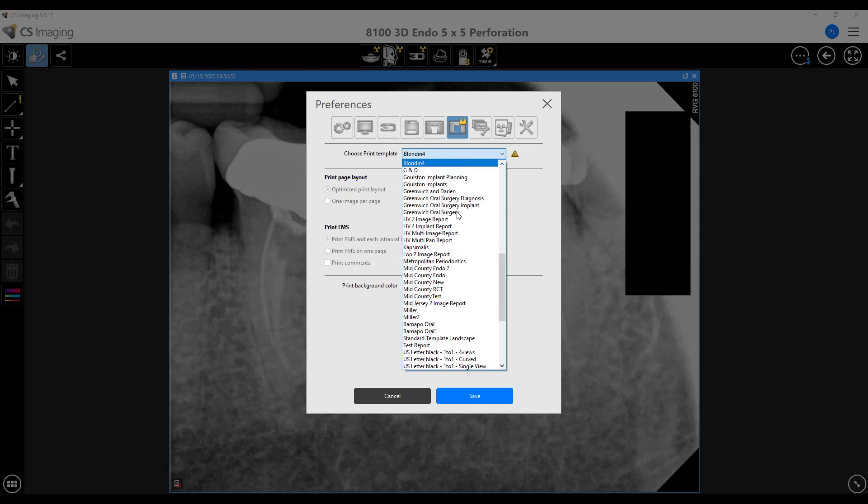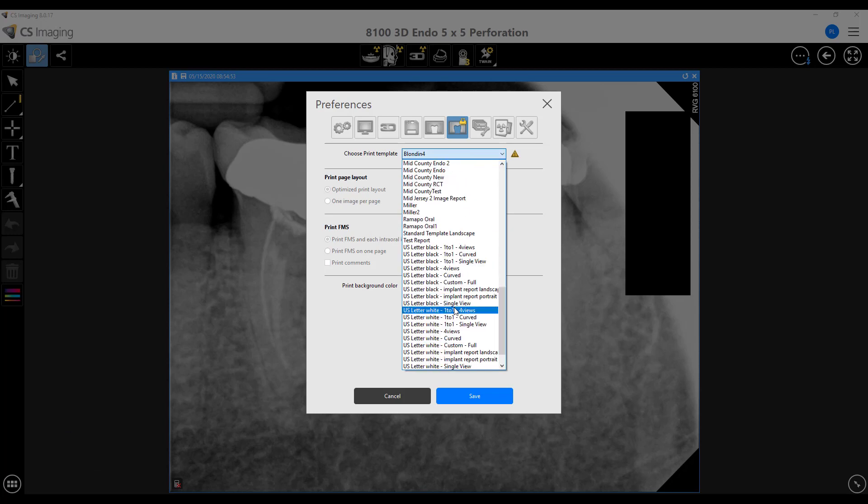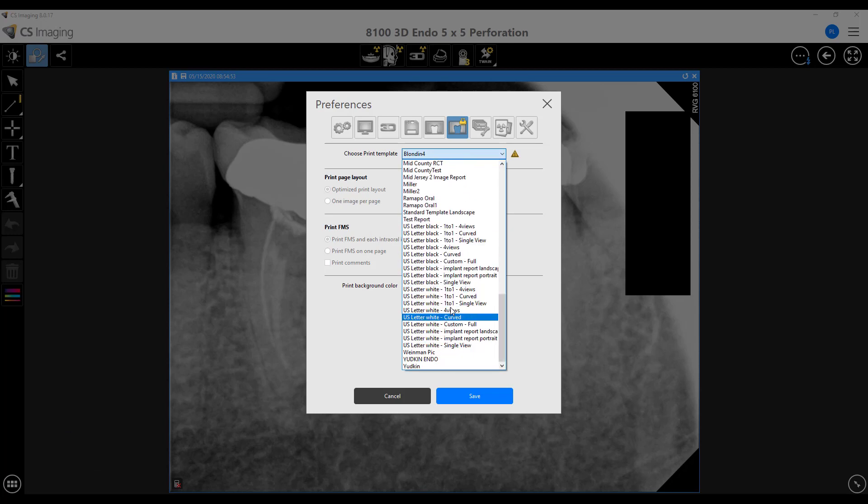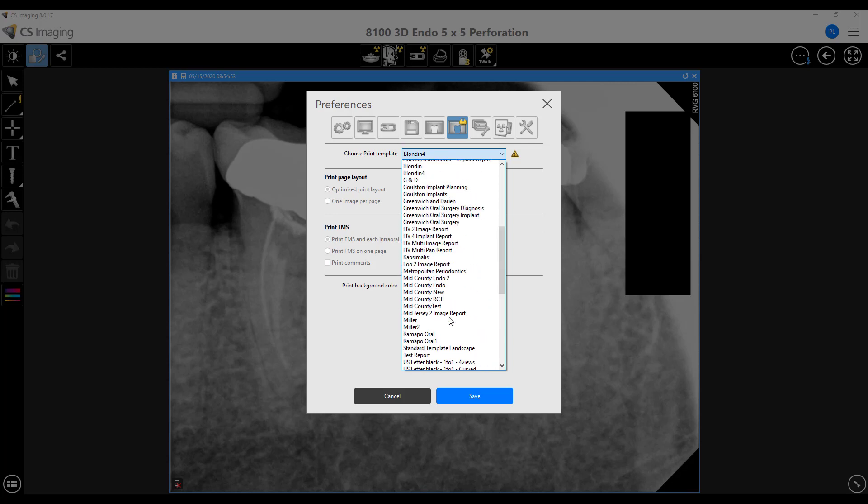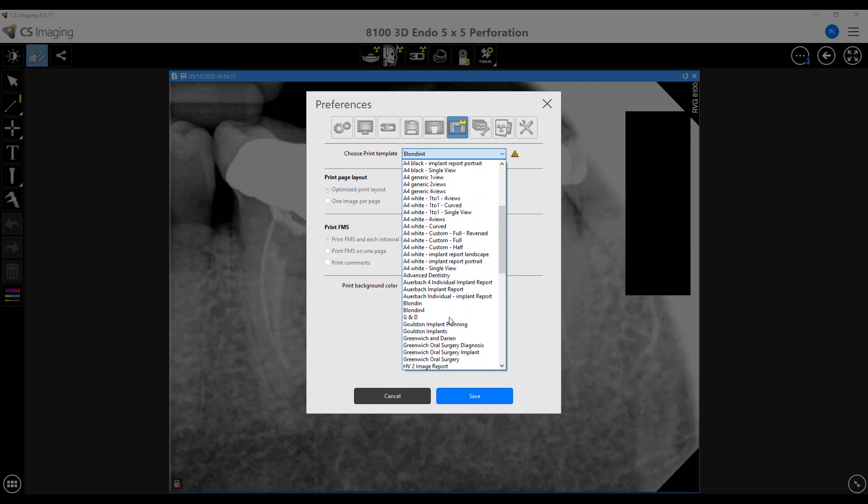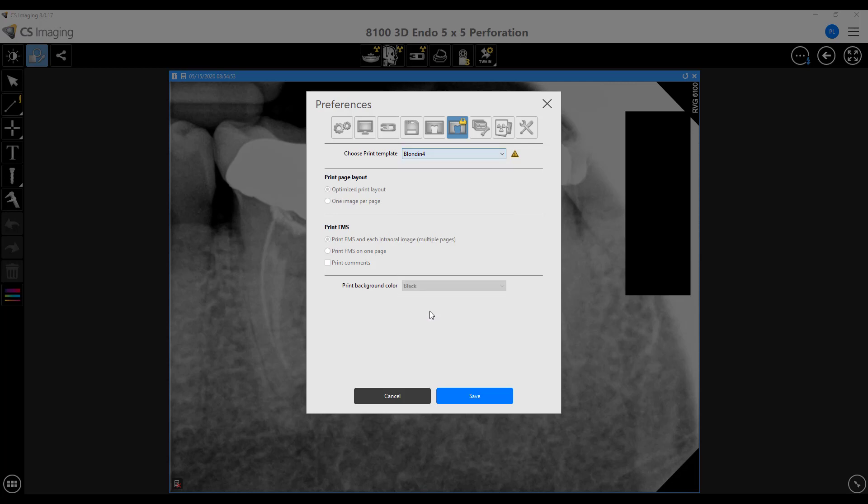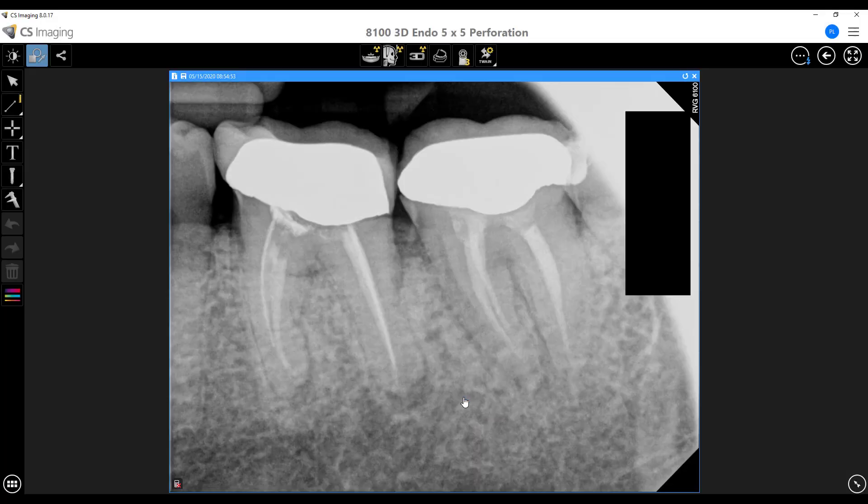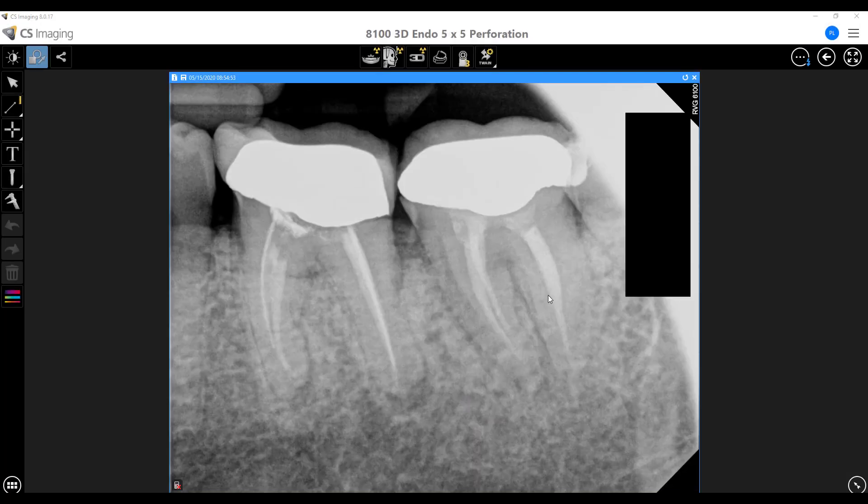And normally there might be a default template like U.S. letter white or whatever. But if you select the same template you're using for your CBCT and voila, you're good to go.